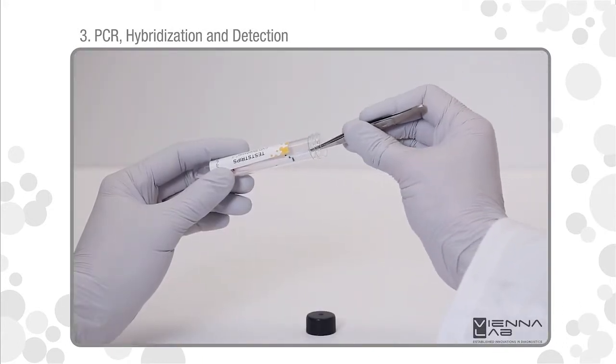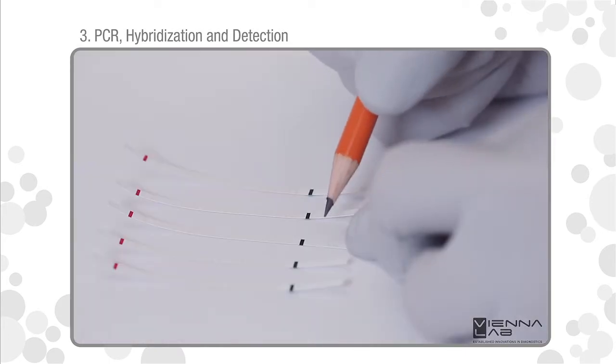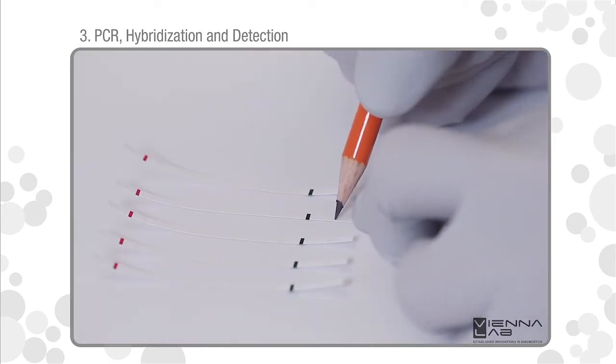Remove one test strip for each sample using clean tweezers. Label test strips outside of the marker lines with a pencil.